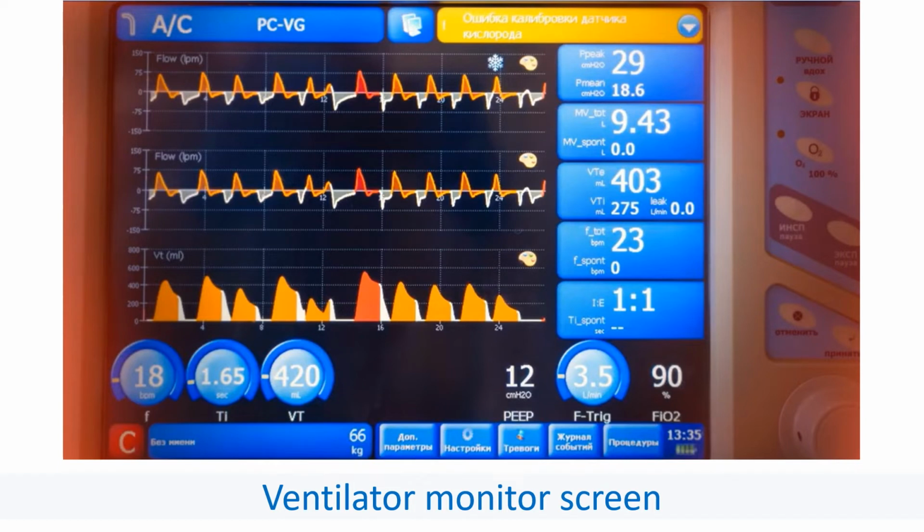Ventilator senses the breathing needs of the individual and gives appropriate pressures to inflate the lungs to either replace the breathing efforts of the individual or supplement spontaneous breathing in various disease conditions. The tidal volume delivered and the maximum pressure at which it can be delivered can be adjusted in the ventilator settings. Using too much positive pressure can cause barotrauma to the alveoli. Various alarm settings can also be tailored to individual needs.